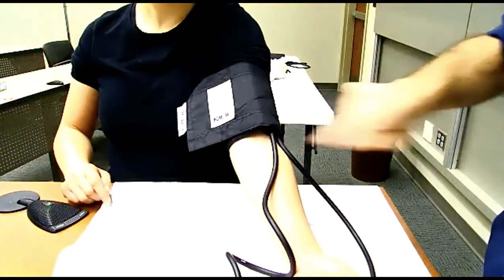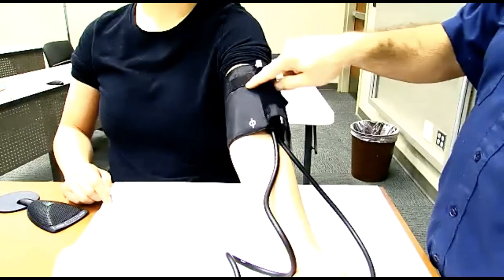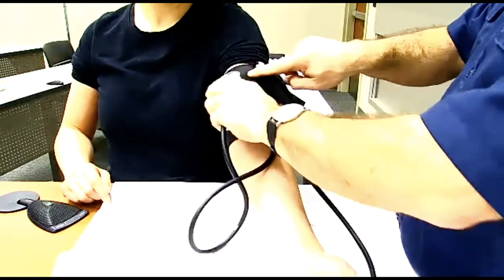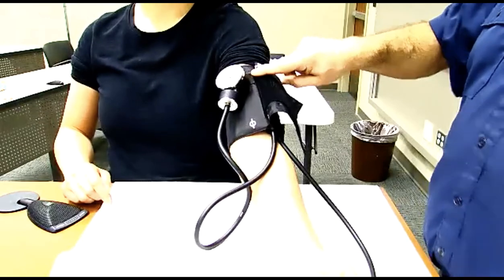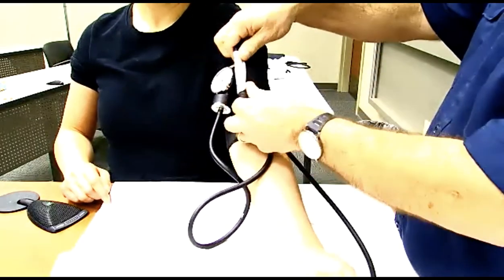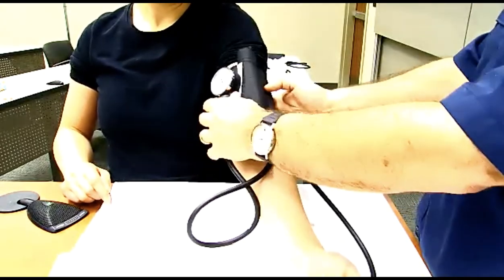Again, about an inch above the bend in the arm. Now, one thing we didn't talk about is, let me see if you can kind of see this here. There's a little notch in the fabric on your cuff. It's designed for you to take the manometer, and then you'll notice there's a clip on the back. So you can actually go through there and clip that on, and that's where it can hold the pressure gauge. Feel free to try to do that. That works well, unless that happens, and then you can't see it. So you can try to fold this in a couple of times and do that, and that might work. So that's okay, but then again, if it tilts to where you can't see it, then that's no good either.